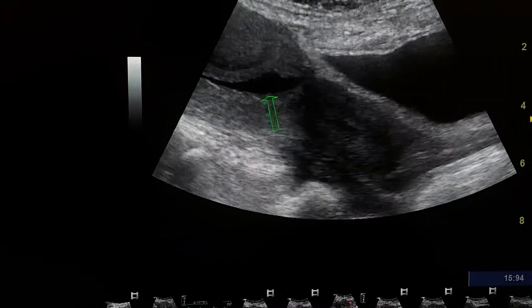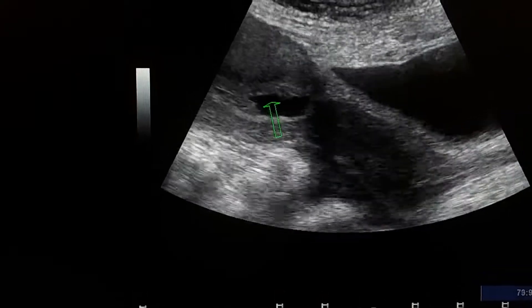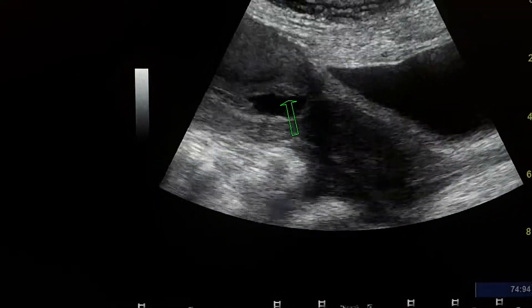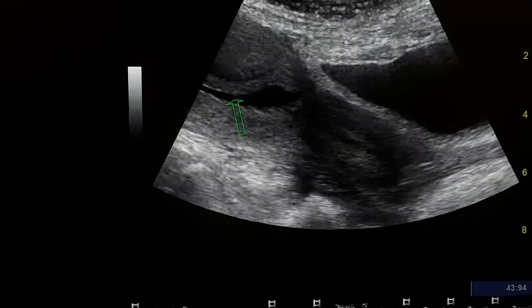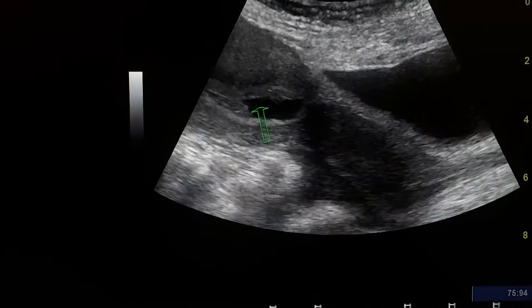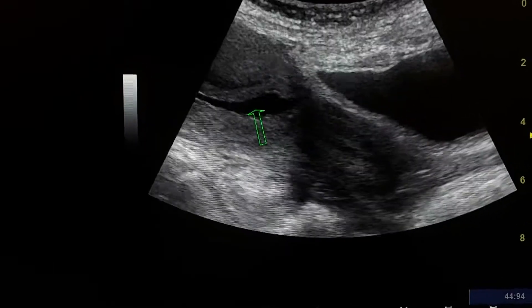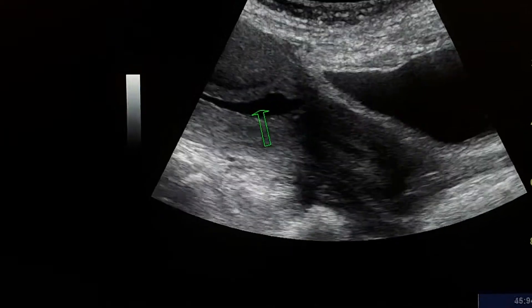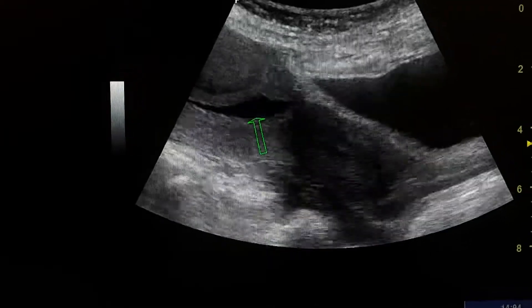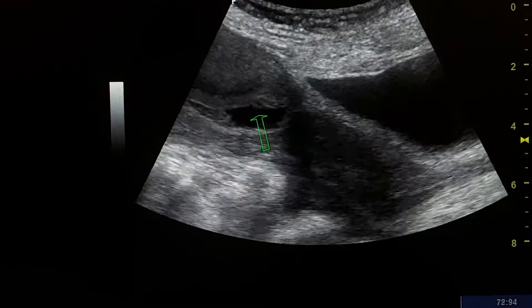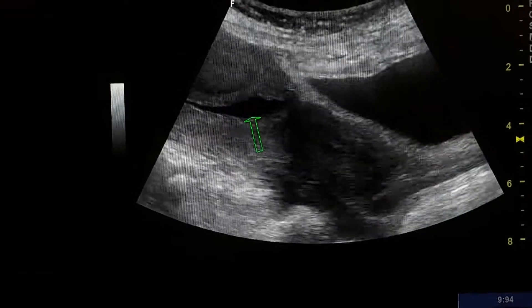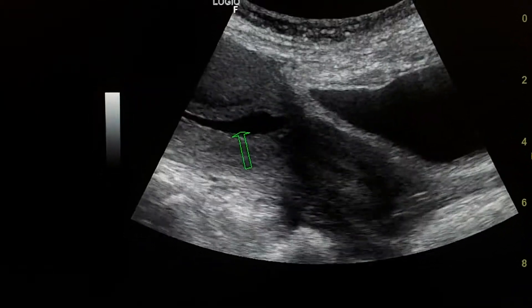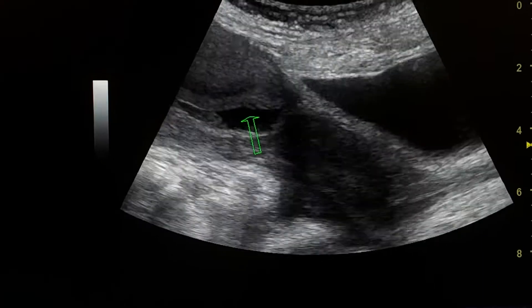This is the pseudo-sac inside the uterus. Pseudo-sacs sometimes get bigger and bigger and resemble a gestational sac, and are sometimes misinterpreted as a gestational sac when the pregnancy test is positive.